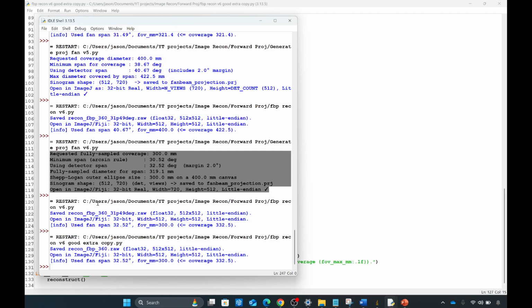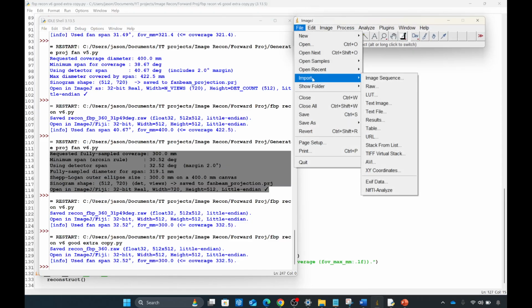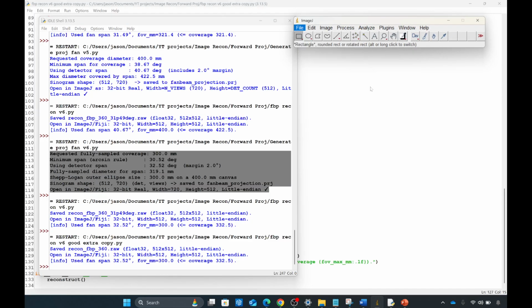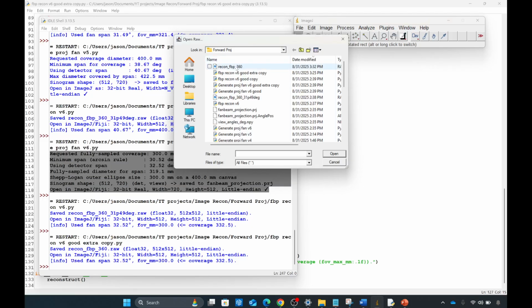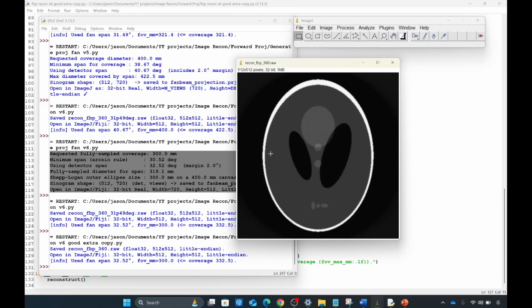Now the reconstruction finishes. Let's use ImageJ to look at the reconstruction. We again use the import raw function, and this is our newly reconstructed image. We open it with 512 by 512, and here you see a crisp Shepp-Logan phantom reconstructed entirely from our simulated sinogram.